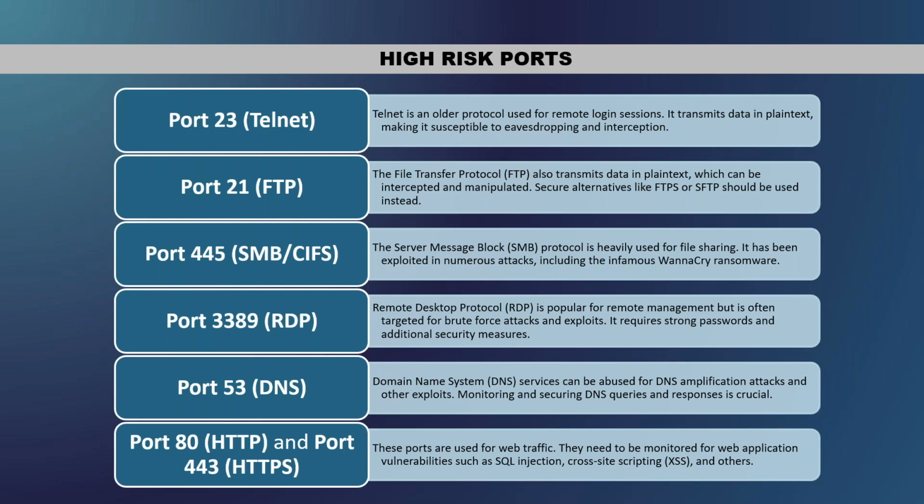I talked a little bit about the network topology and what's necessary. There are always high-risk pieces of equipment. I call them high-risk because this is where the cybersecurity attacks come in, right? And they're constantly changing, so this could change in the next day or so. But some of the more prominent ones are FTP, the file transfer protocol, which is how vendors are accessing your files. That is very vulnerable, along with 445, which is shared drive access. 3389 is RDP, which is remote access, and we've already seen a lot of cybersecurity attacks with that, right?